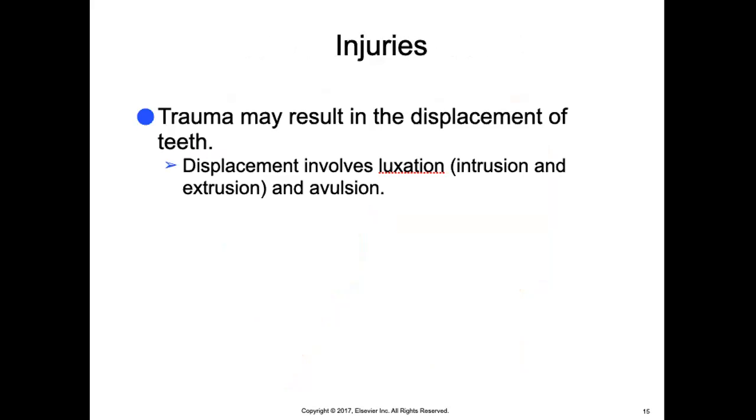Trauma may result in the displacement of teeth, so this has to deal with luxation. And luxation can either be intrusion or extrusion and avulsion. Dental images allow the evaluation of structures after tooth displacement.